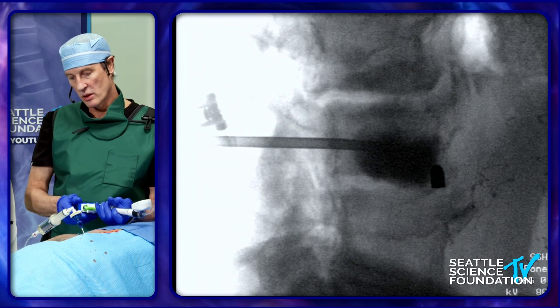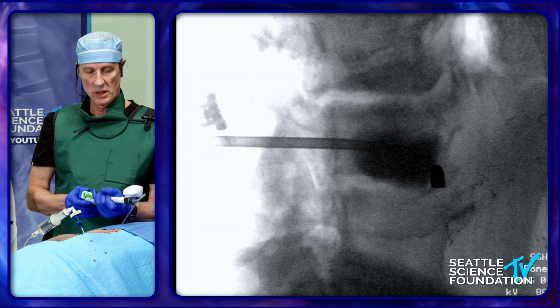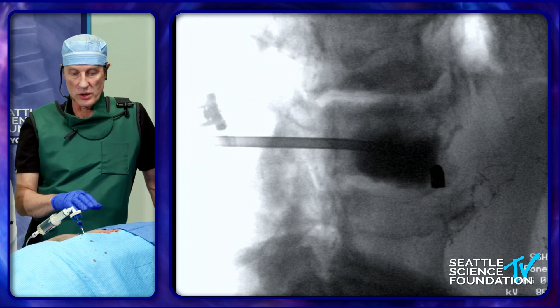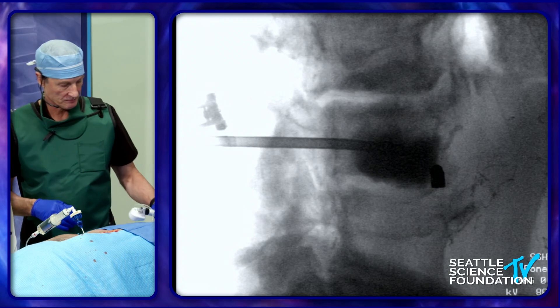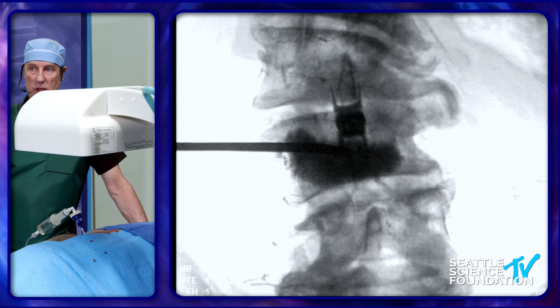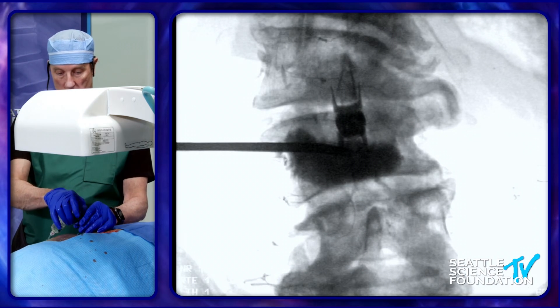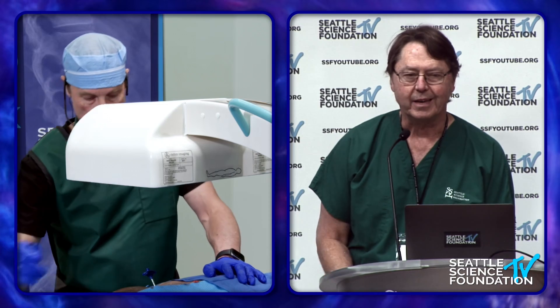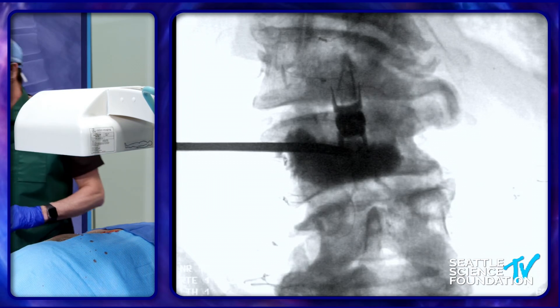We've injected the entire content of this cement container, and that's actually a very decent fill. The goal is between pedicle, end plate to end plate. Obviously we didn't reach the superior end plate, but we don't need to because the density of that sclerosis is very profound, as you can see by the bending of the needle. That's a pretty decent lateral view. We'll come around and take an AP shot to see the distribution. Your goal should be between pedicle end plate to end plate, maximizing the height reduction — and on the AP, what you want to achieve with your balloon and fill is from the medial border of the pedicle on the contralateral side to the medial border of the pedicle on the ipsilateral side, because that gives central strength to the vertebral body.